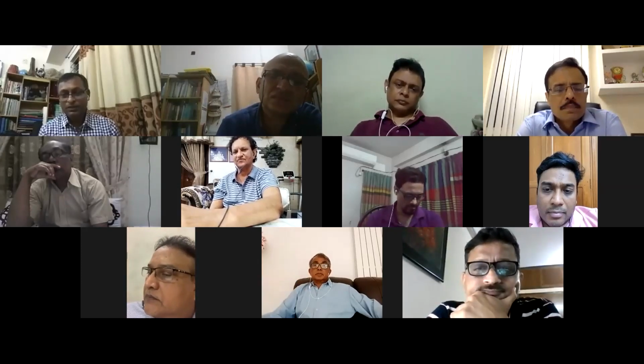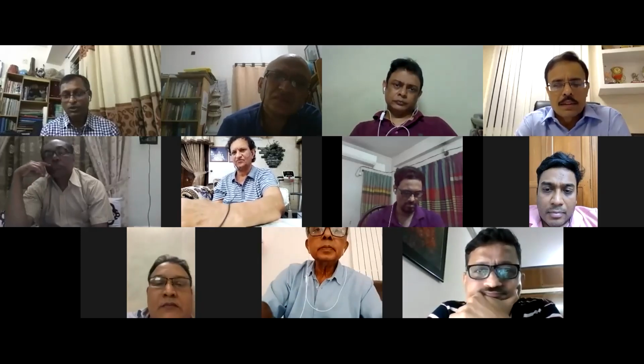One question to Vipul sir from Dr. Amir Hussain. Is it necessary to use contrast in vessel wall imaging always? And what are the findings in vessel wall imaging in ruptured aneurysm in subarachnoid hemorrhage? I think the second question is already answered. So, about the first question, contrast enhancement is very important because, as I discussed, in vasculitis you will see concentric enhancement, while in atherosclerosis we'll usually see eccentric enhancement, while in RCVS and moyamoya we will not see much enhancement. So enhancement is very important in trying to differentiate. So we almost always do vessel wall imaging with contrast. Okay, thank you, sir.